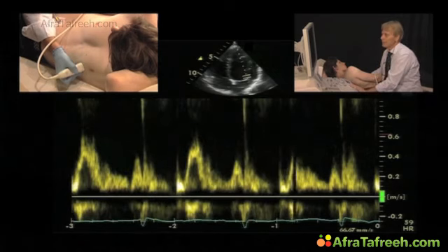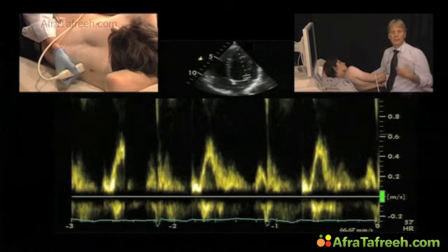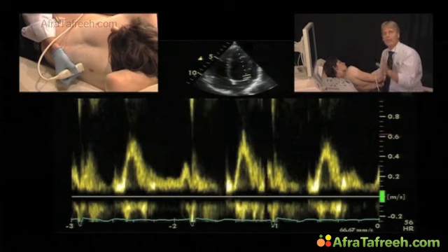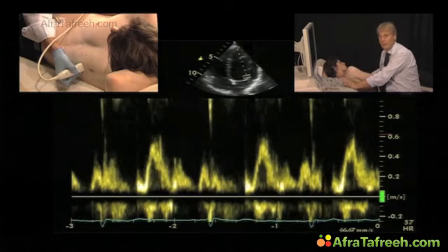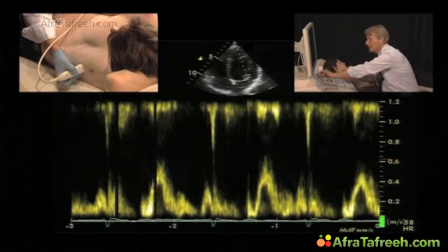The next thing that is important is it's better to freeze the 2D image while you perform the pulsed-wave Doppler. You can use the image as a reference, but in the long run, if you want to do some measurements, it is probably better to freeze the image, because the quality of the Doppler is better if you freeze the 2D image. You can optimize the image.